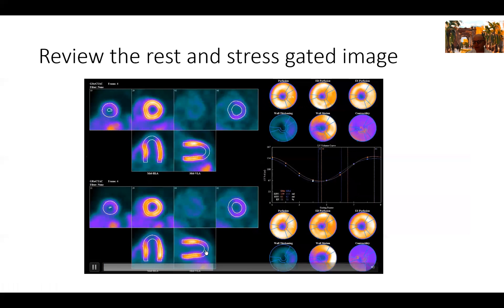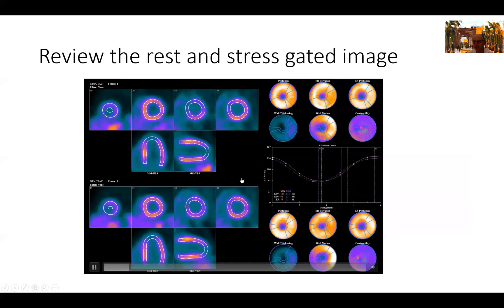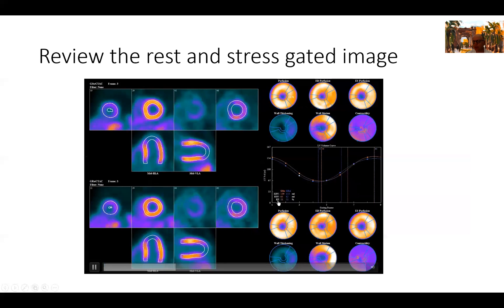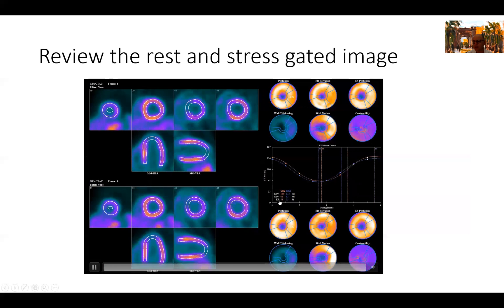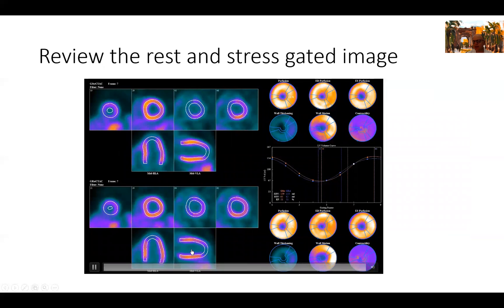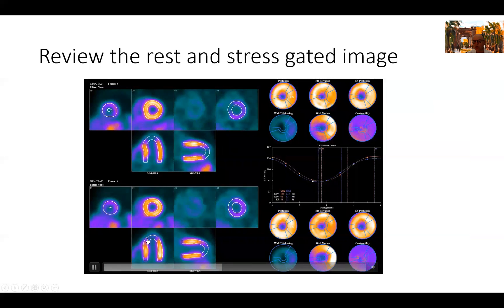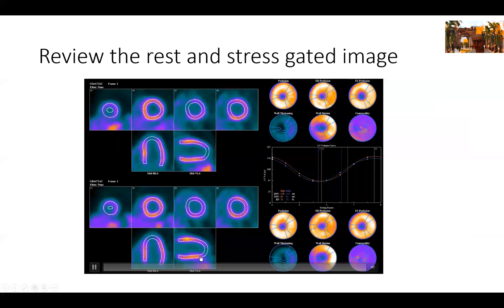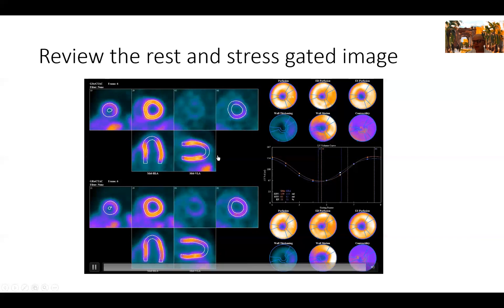Then we go to the gated images. We can see these contours are very nice, tracking the heart nicely in rest and stress images. EF is mildly reduced. It's not normal, but it's not very abnormal. It's around 50 to 53% here. There's akinesia of the apex here. As you can see, there is no brightening of the myocardium in the apex indicating akinesia.